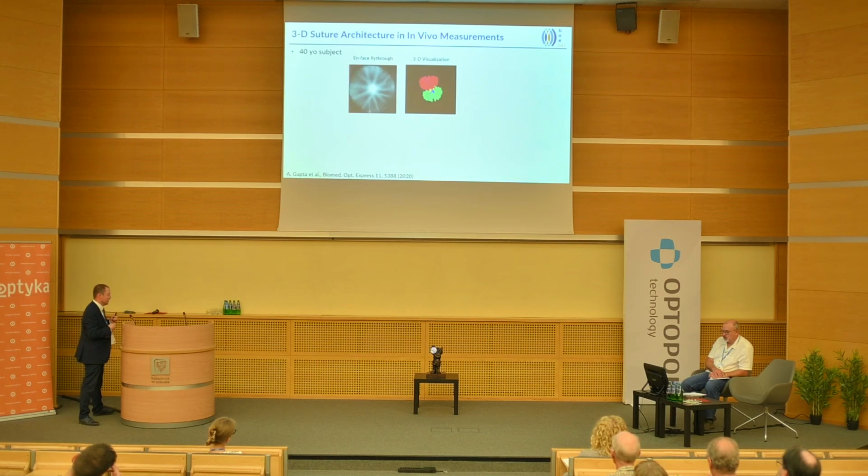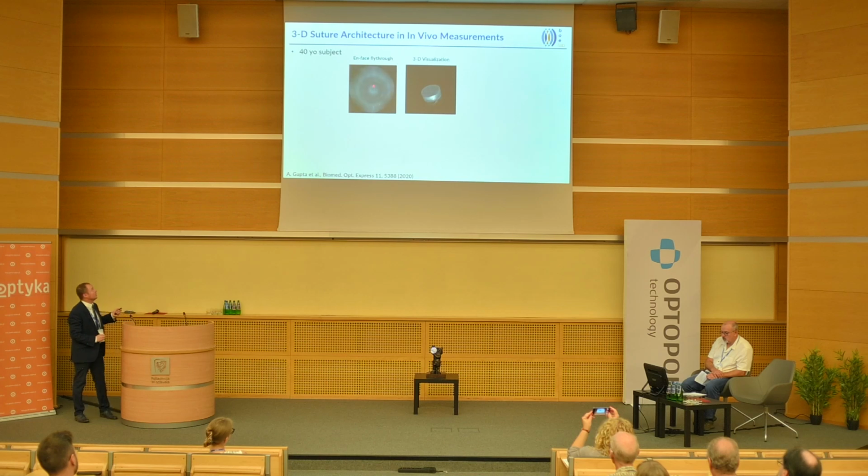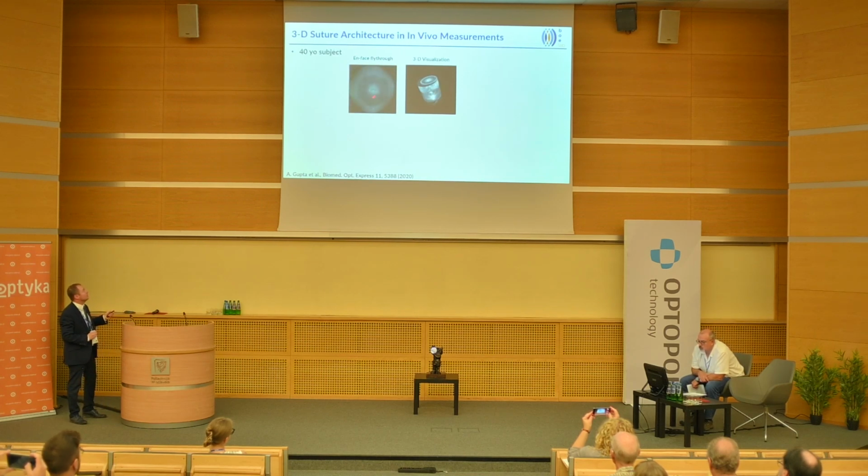What is really interesting, I'll show you the movie showing a fast flight through different depths of the lens, and you can really see that we have this complex pattern, and there's also this BMW pattern, this Y and inverted Y pattern in the nucleus.